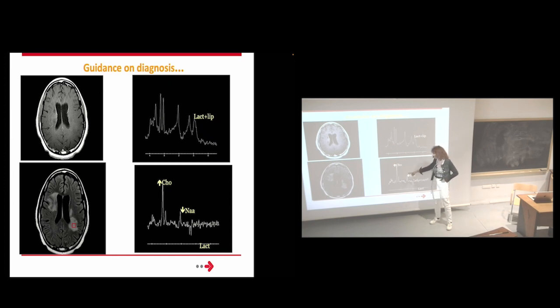And here I show you just an image of the signal at a time t, of course. But you can also have evolution. If you stay longer in the machine, then we can have evolution of the signals. Sometimes what we do is make acquisitions during the morning, then after lunch, and at the end of the day, because of course we cannot stay all day in the machine. We have made some tests with volunteers that come in the morning, come back after lunch, and then come just before dinner to analyze the evolution of the metabolites during the day.